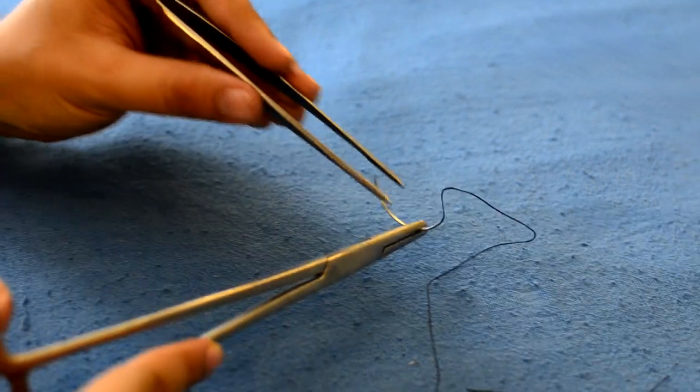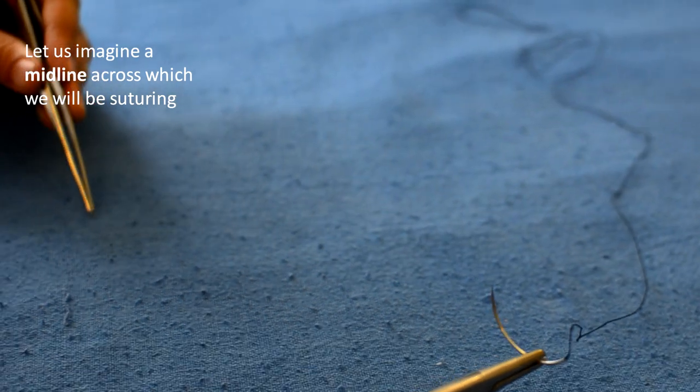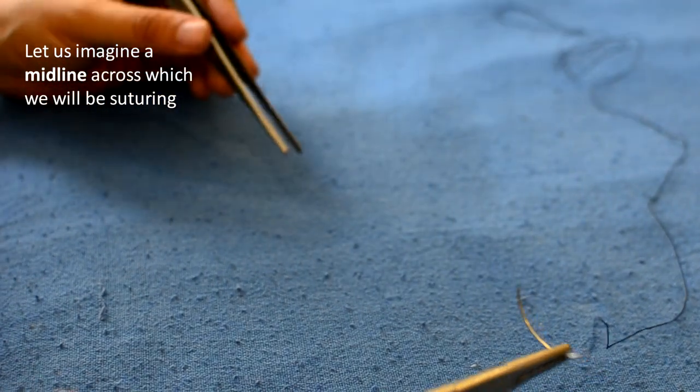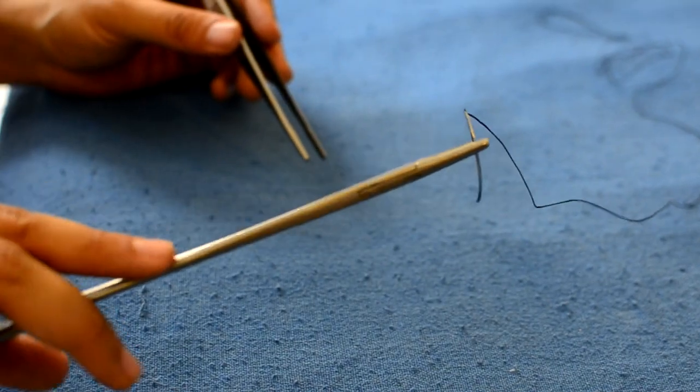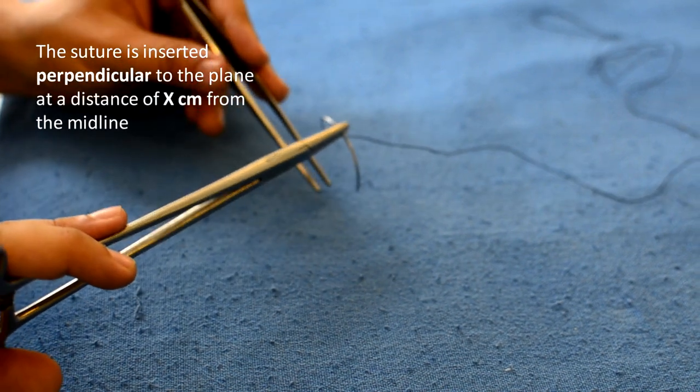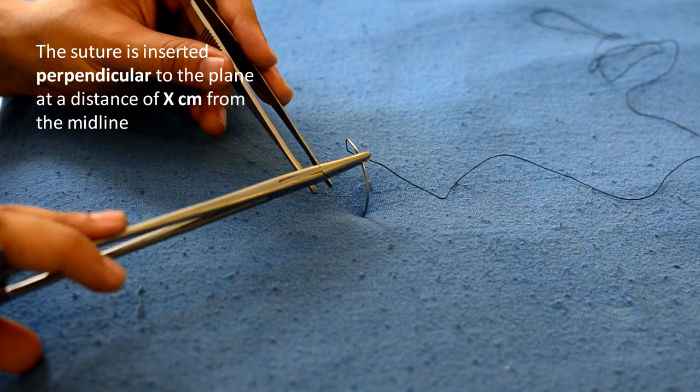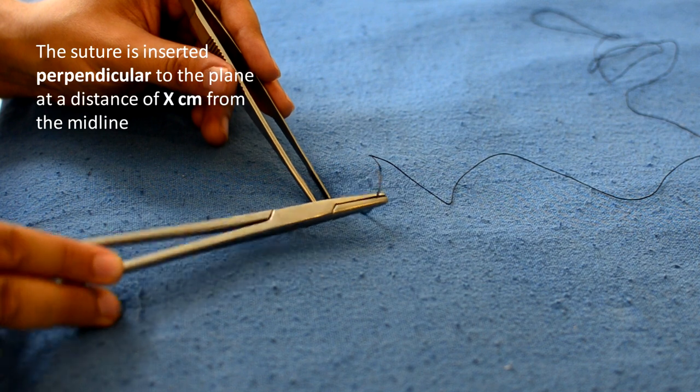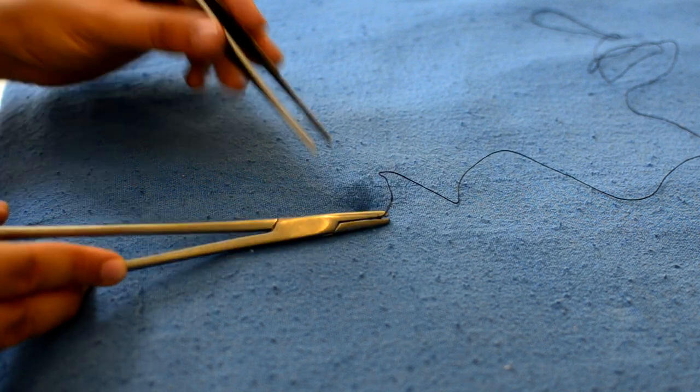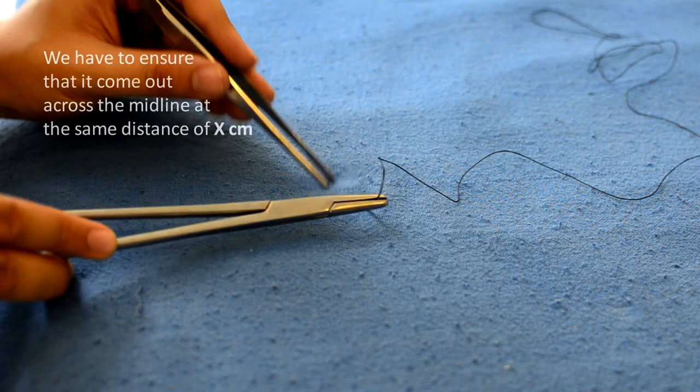Let us now imagine a midline across which we will be suturing. The needle is introduced perpendicular to the plane and we assume a distance of x from the midline. When the tip of the needle comes out onto the opposite side, it should be at the same distance of x from the midline.